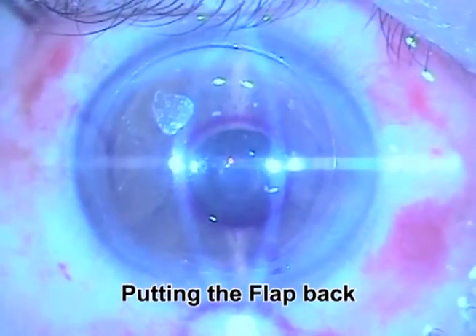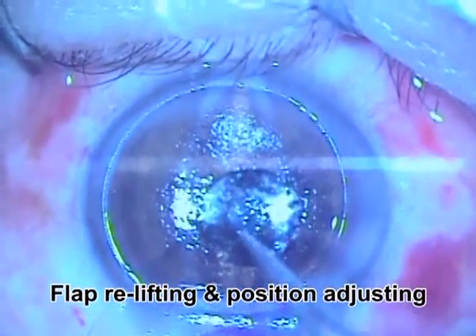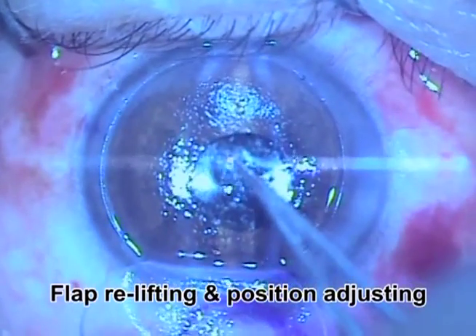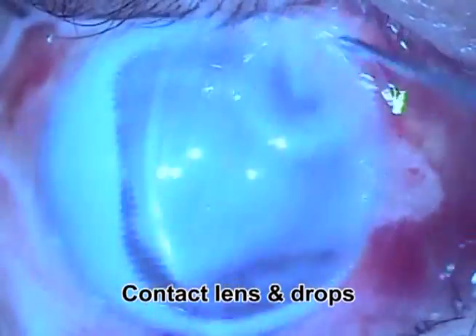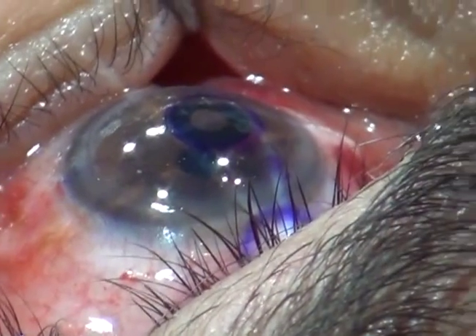If you are not close to perfection, you will re-lift the flap and adjust the position of the inlay a little bit until you reach the preferred position. After that, you clean the gutter, apply a contact lens and drops. The surgery is complete.